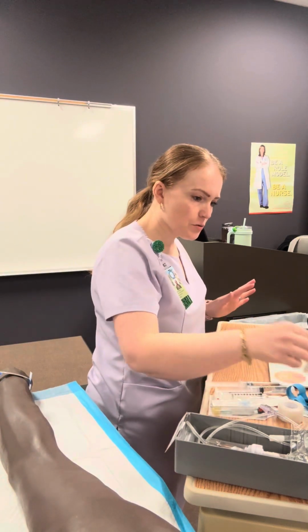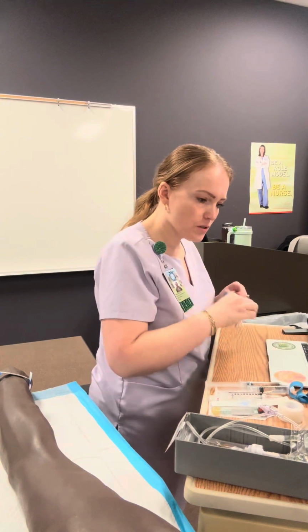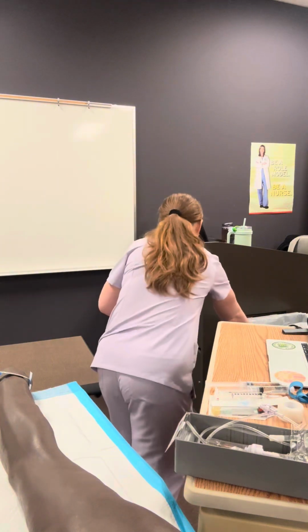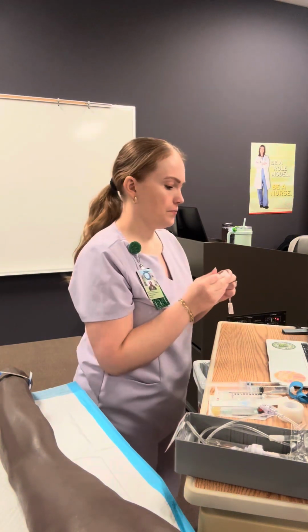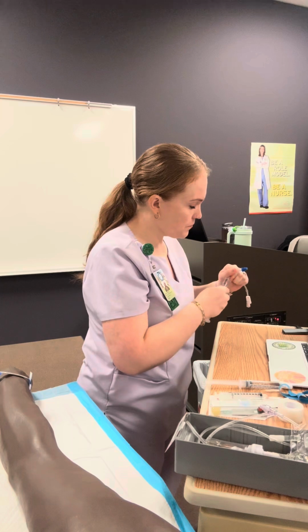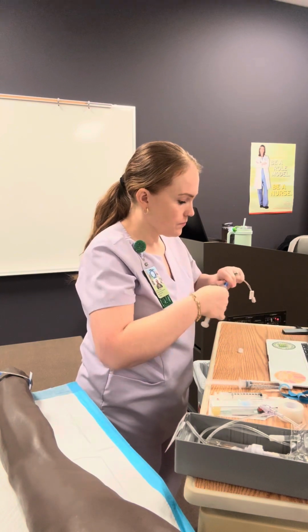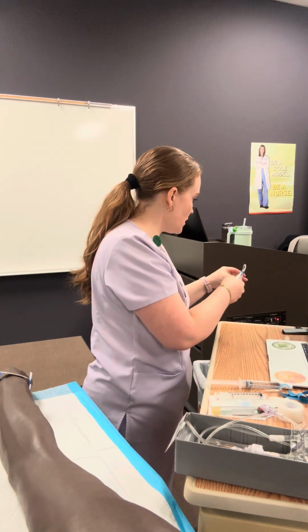So I'm going to grab my short extension tubing here, and I'm going to start by cleaning the hub on this side, and attaching a flush. And I'm going to prime this over the trash can.